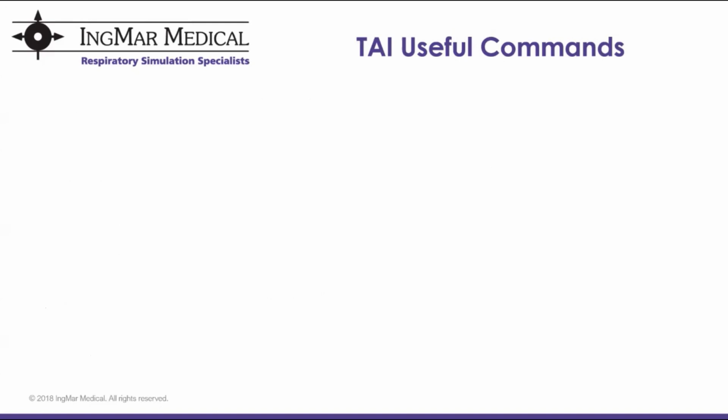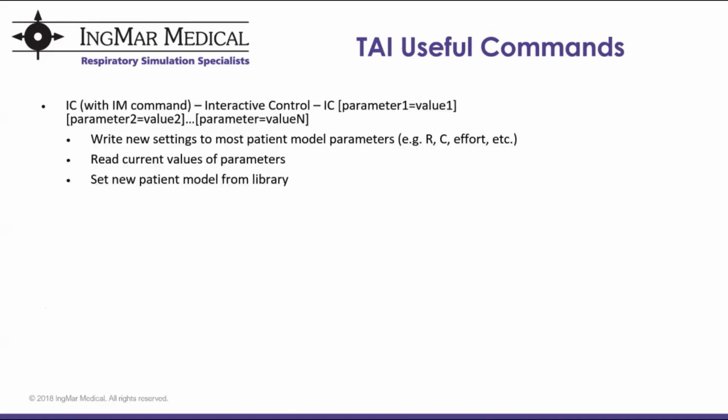Let's look at some of the commands based on manipulating the patient model as well as receiving output data from the ASL. One of the most useful commands is the IC, or interactive control command, along with the IM, or interactive mode command. The IM command moves the simulation into the "interactive mode" and provides interactive control to the simulation or to the test.